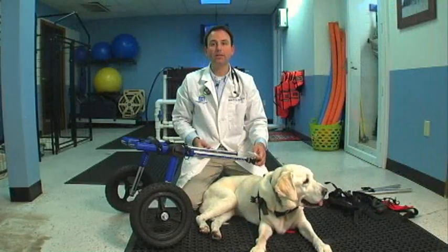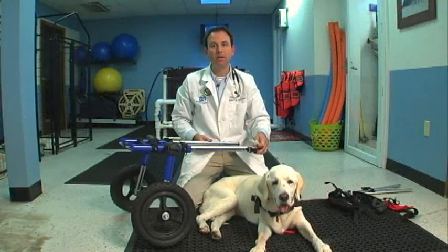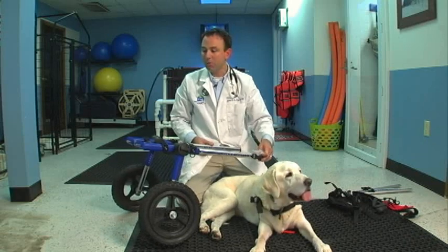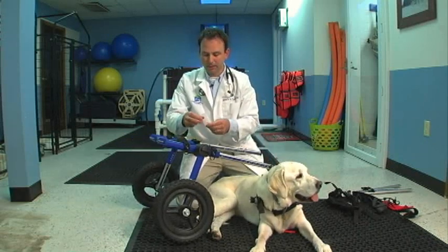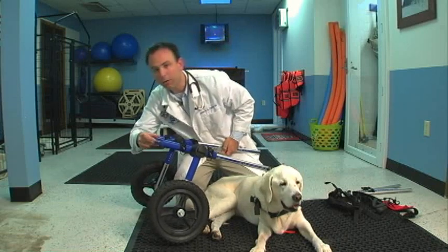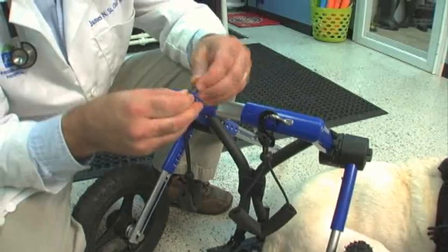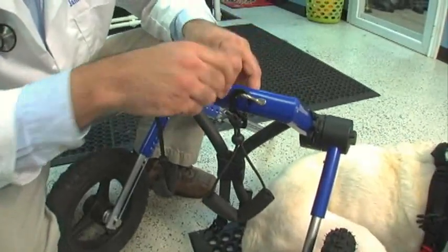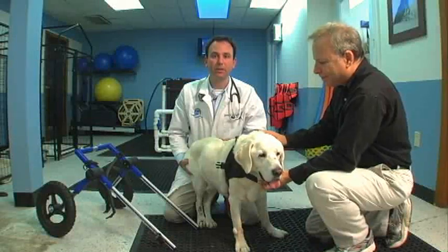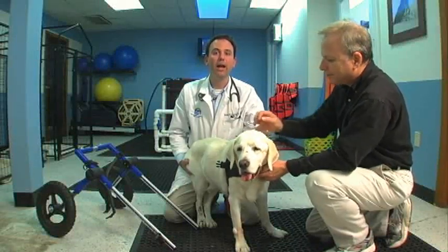One thing you'll notice is that when you have the cart adjusted, there's a little play in the cart. That doesn't affect the function of the cart, but you can stabilize it by putting the set screws into the little holes in the back. This will secure it down. It is definitely easier initially, when you're getting used to the cart, to have a helper do it.